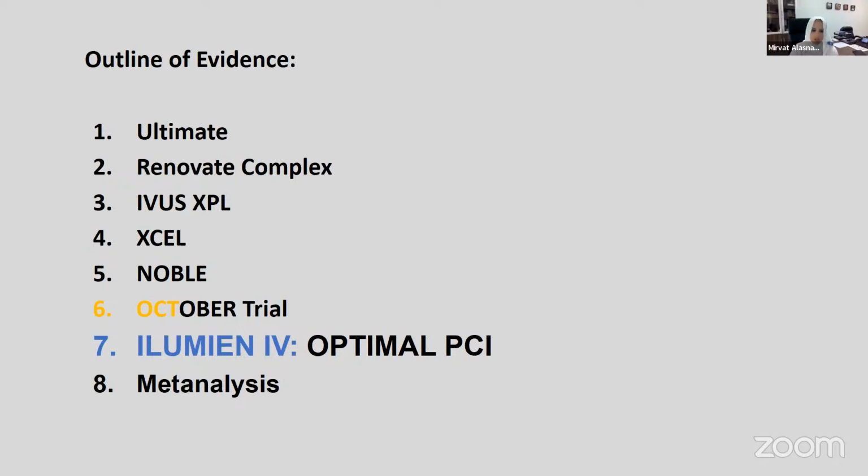Yeah, absolutely. So I'm going to go over these really quickly. I know you see eight slides here, but it's not going to be anything long because, as I said, the data, the evidence is there.